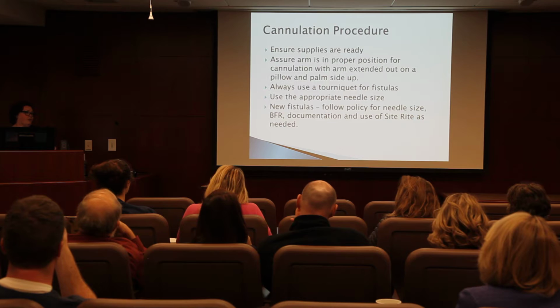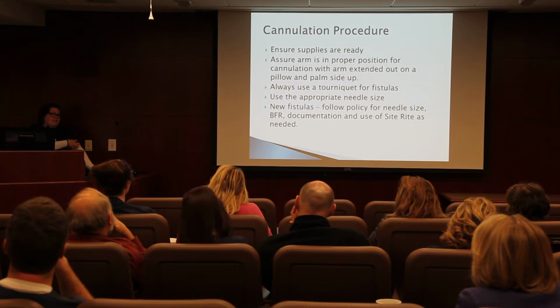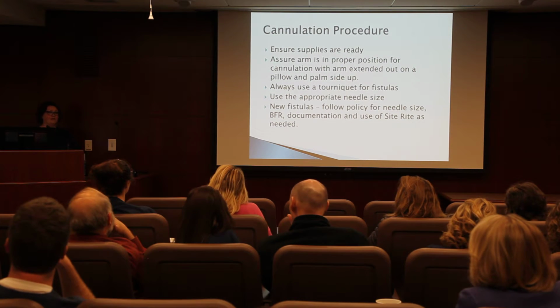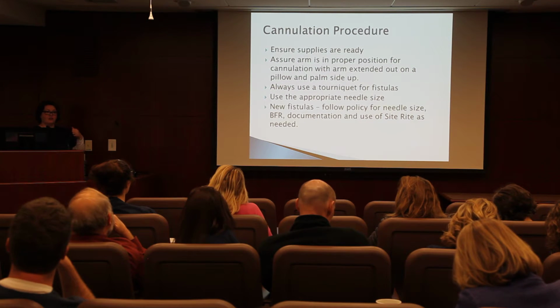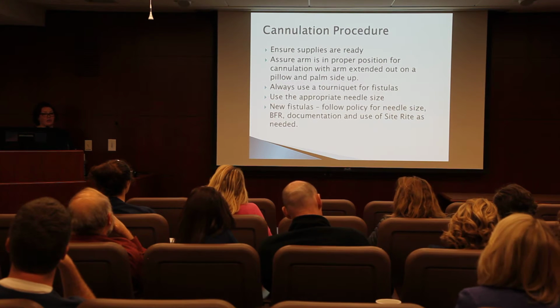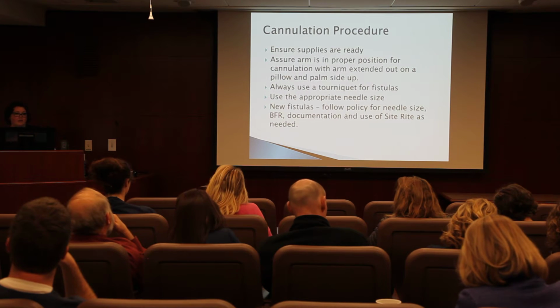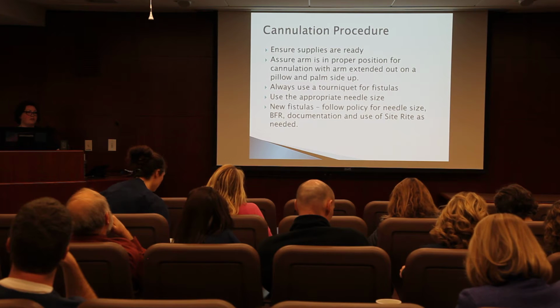Always use a tourniquet with fistulas, and I know a lot of people say, oh, but I can see, it's nice and big. It's not really for you, it's for the life of the fistula. It makes the wall of the fistula tighter, tougher, easier to go in. So always use a tourniquet with a fistula, never with a graft. And then we talked about appropriate needle size. 17-gauge needles are just fine for you guys.